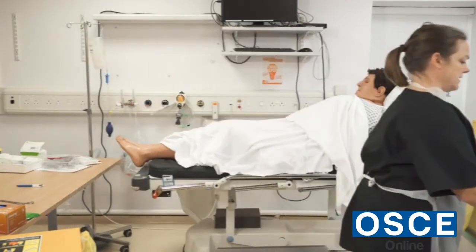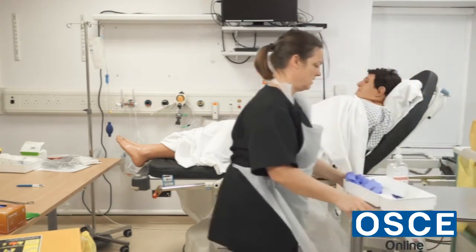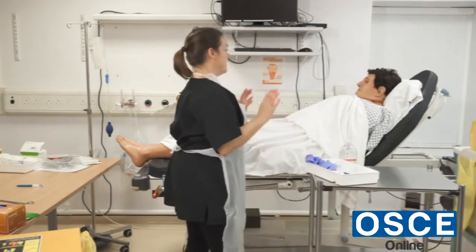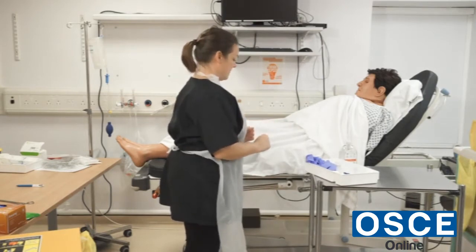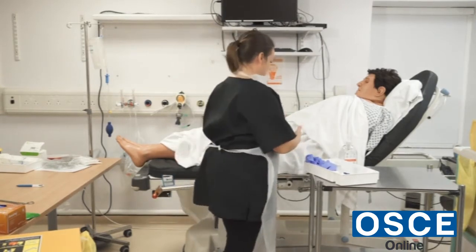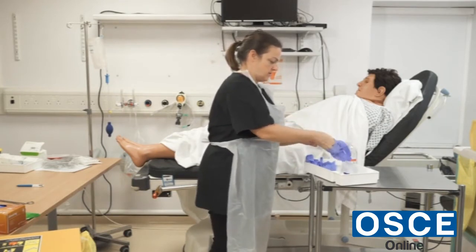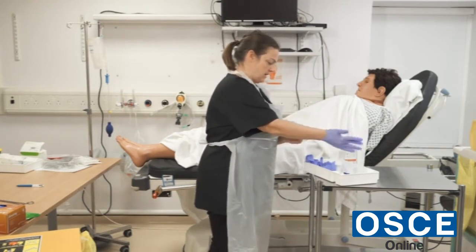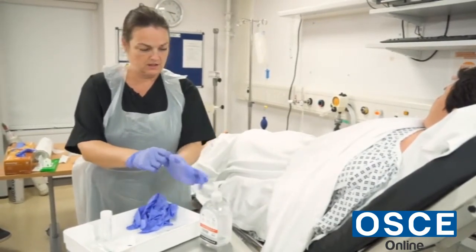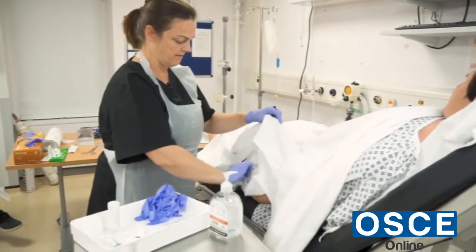So I'm back again. I'm going to take a sample out of your catheter — is it okay for me to expose the area? The patient has agreed that it's okay. So I would don my gloves. Don't touch the catheter without gloves on, ever.